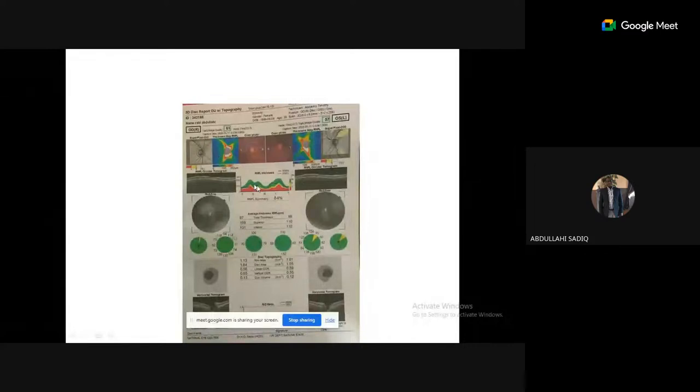And then if you come down here, you can now look at this graph also. And then move here, you can see the quadrant distribution of the retinal fiber layer thickness: the superior, the inferior, everything is appearing in green here.